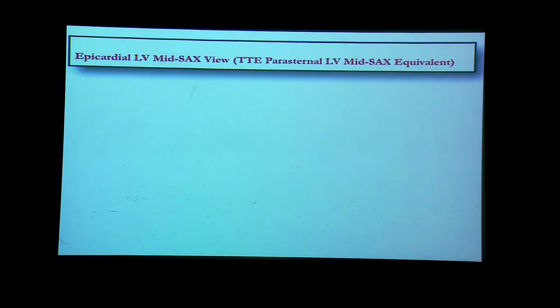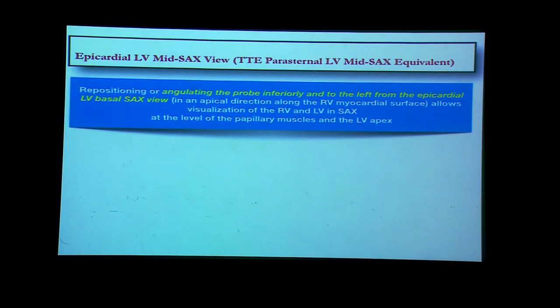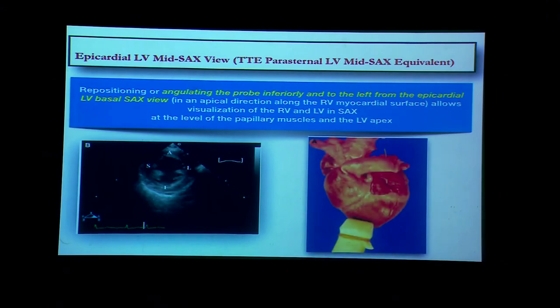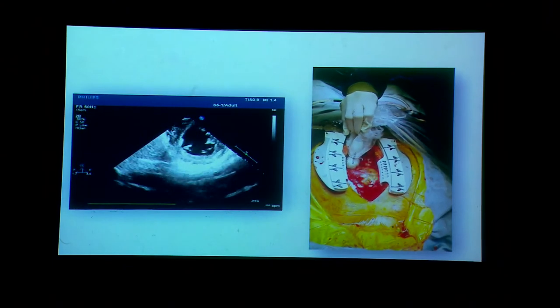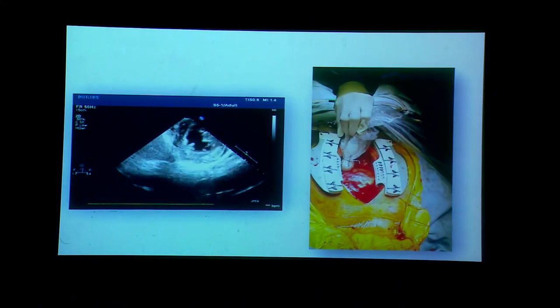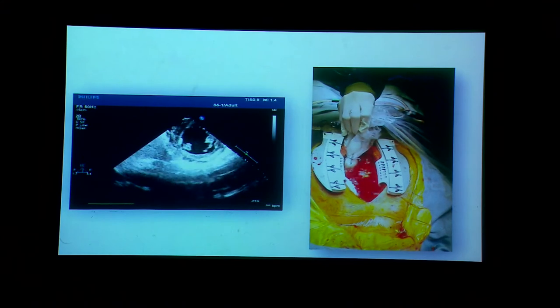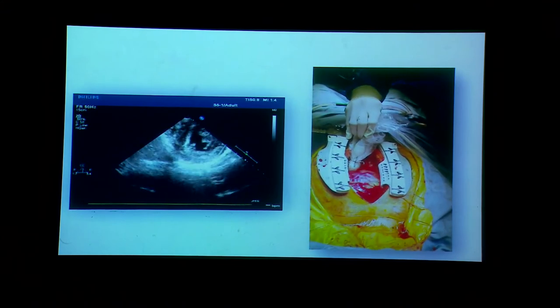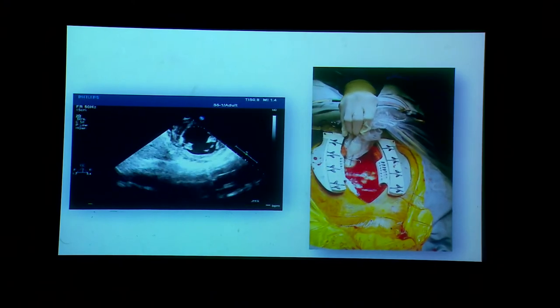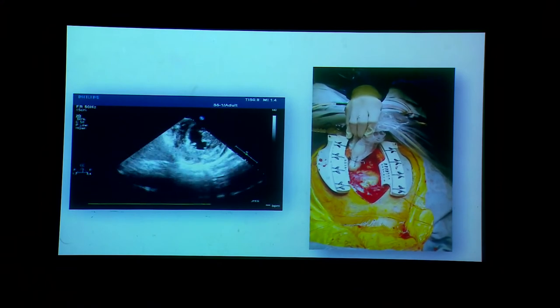From the basal view we go to the LV mid short axis view. From the previous position, we apply an inferior angle to the probe and what we see is the papillary muscle — the mid-papillary muscle view. The right side shows the anterior papillary muscle and the left side shows the posterior papillary muscle. We can see complete ventricular geometry, wall motion abnormalities, RV dysfunction, and other problems by observing the interventricular septum — all achieved by angulating inferiorly to the left.